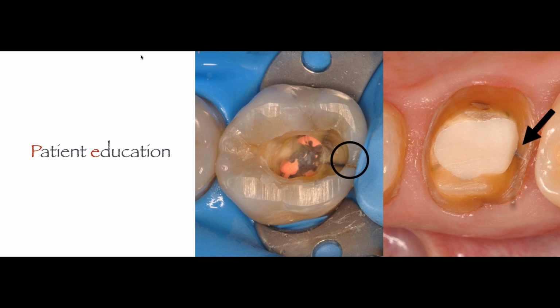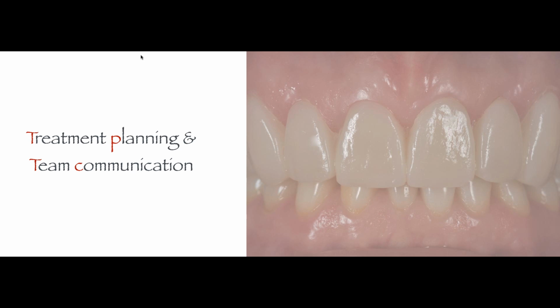So we build up the core, we prep the tooth, and there is a fracture again. And now we're going to go ahead and take an impression, send it to the lab, and finalize this treatment for the patient. The other reason why we use dental photography, right?